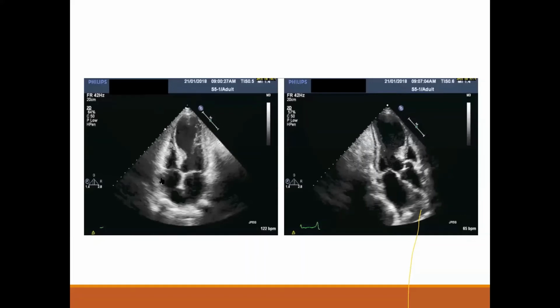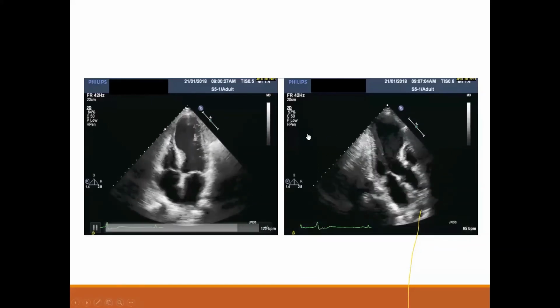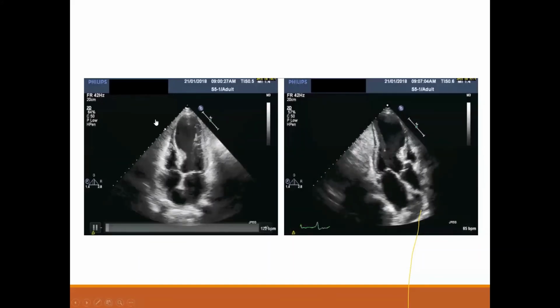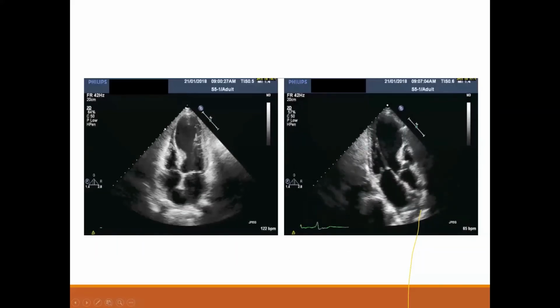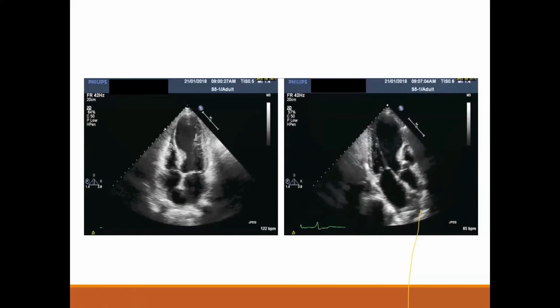So, we said risk stratification, and I agree with this risk stratification after clinical stabilization. Now, in this case, because we don't know, it looks like ischemic cardiomyopathy, right? Before diving into coronary angio, I think we have to make sure that we are dealing with viable myocardium. Viable, okay? Yes, exactly. So now, if I ask you a question in the exam about this cardiomyopathy in a patient who came in with decompensated heart failure: if I said the patient came with acute coronary syndrome, that might be different. Or if I said the patient came with angina symptoms, it might be different.